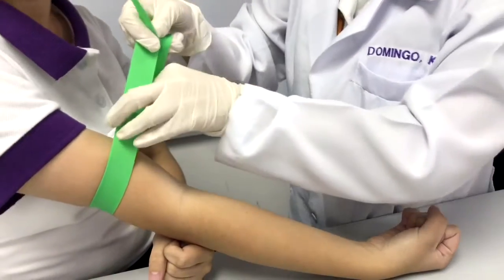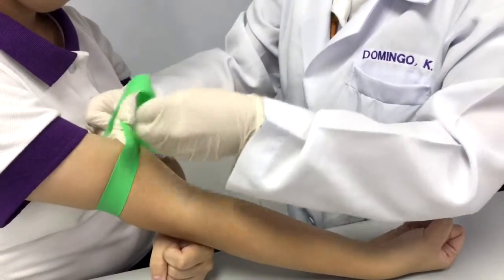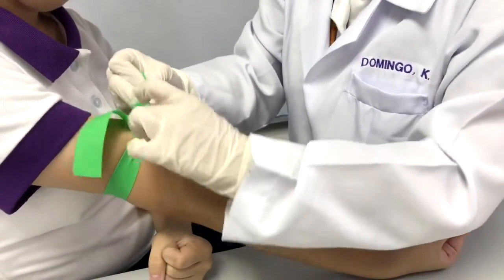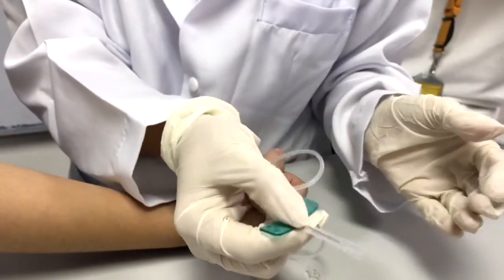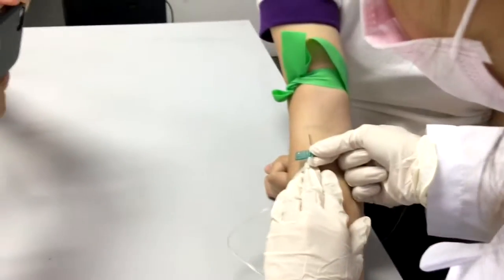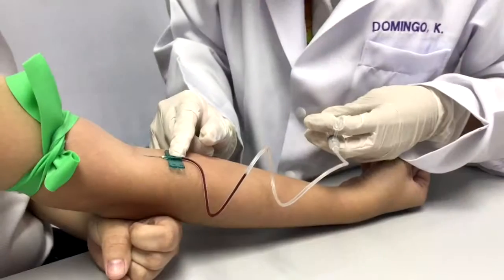Reapply the tourniquet. Uncap and inspect the needle. Anchor the vein to keep it from rolling and insert the needle. Make sure not to touch the antecubital area to prevent contamination.